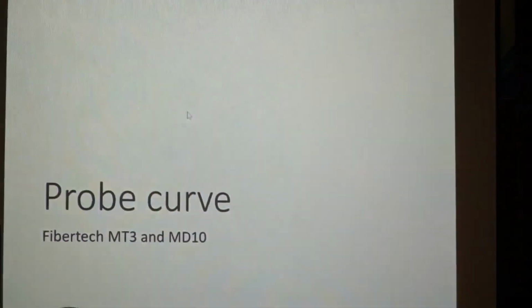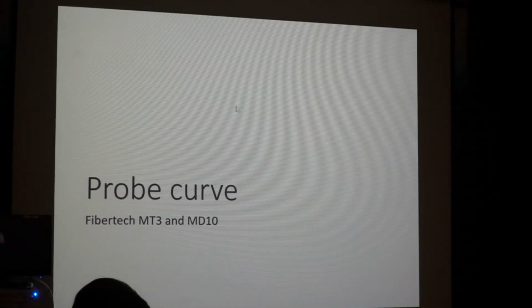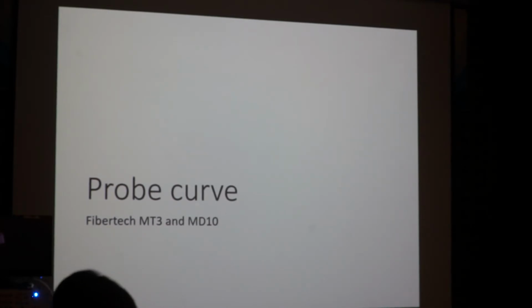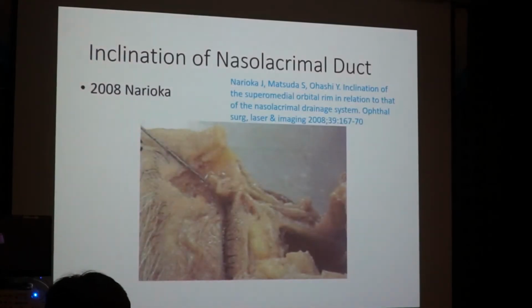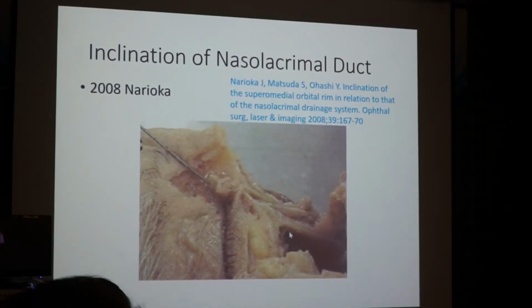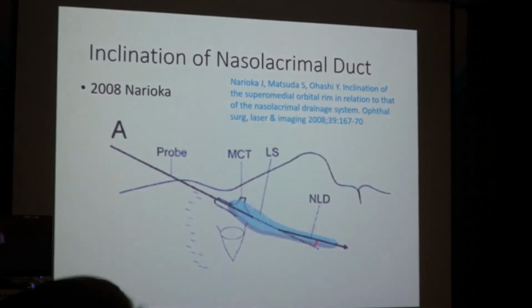So the next one is a very important topic, very important. Why do I choose the curved probe? First of all, I would like to introduce Dr. Narioka's study using cadavers. He inserts a straight lacrimal probe from the punctum to the lacrimal sac of the cadavers and compares the inclination of the probe and the inclination of the nasolacrimal duct.